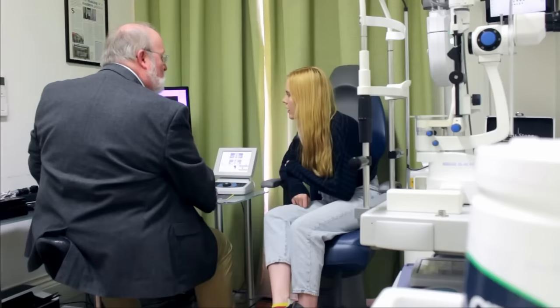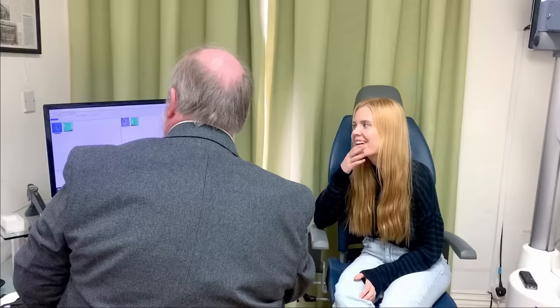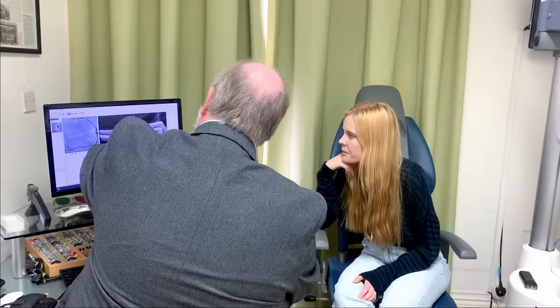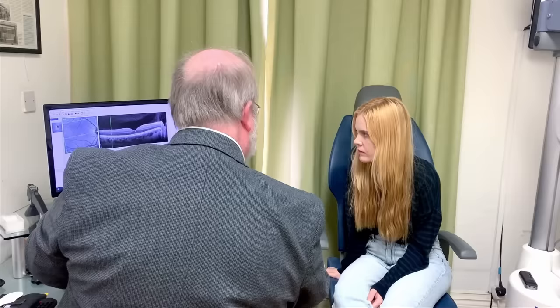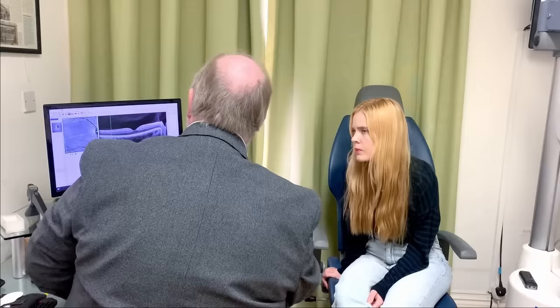So the optic nerve on your right eye looks very happy. And what we'll do is go to this one. Now this one does this foveal area, and as you can see there's a little dip here. And the dip is there because it spreads all of the nerve fibres away from your vision. So all around the rest of the peripheral part of your eye, the light has to pass through all of these 10 layers of the retina to get to the bottom layer, or the 10th layer, which is your photoreceptor layer.